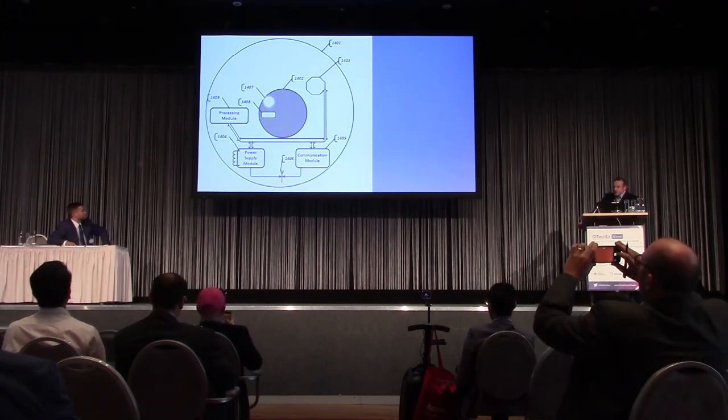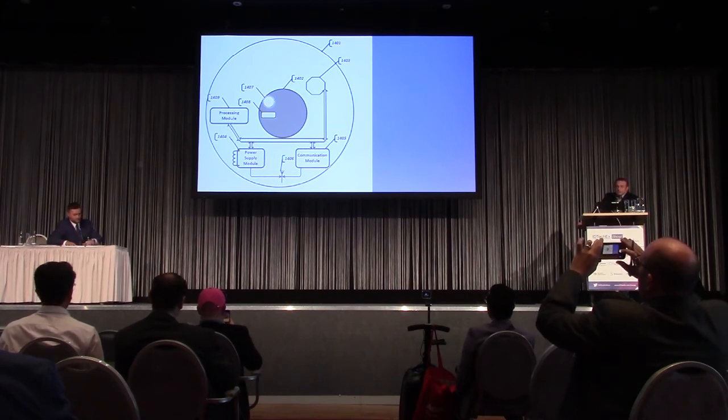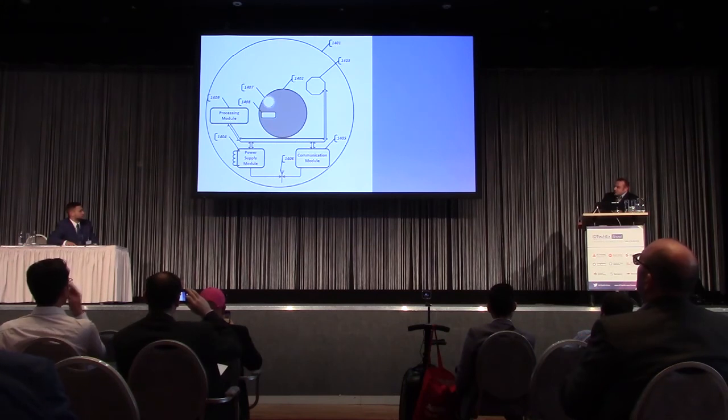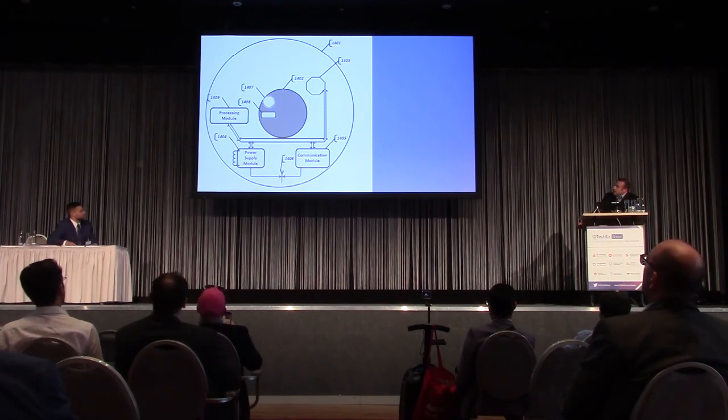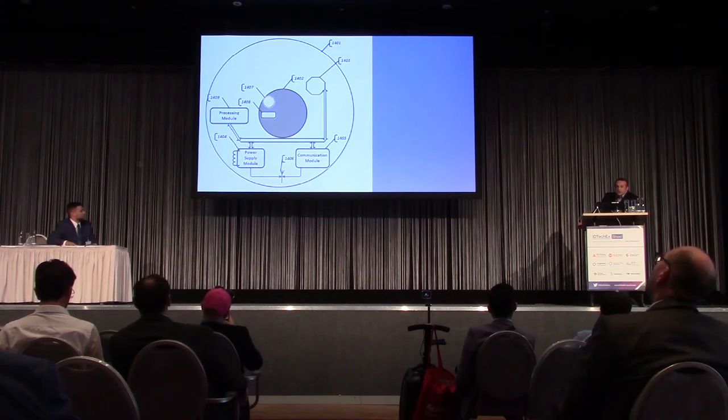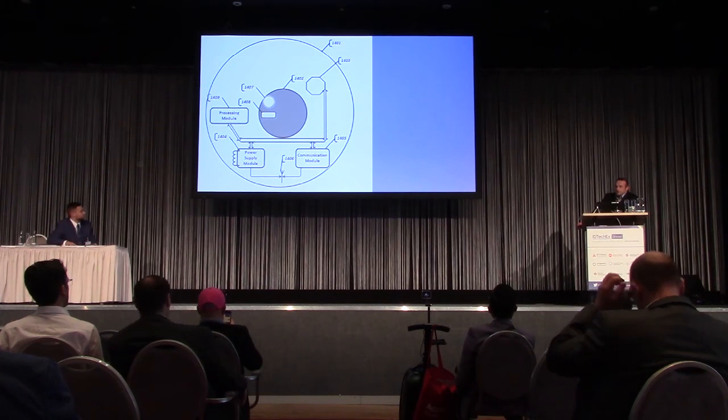So imagine that at 1403, this is an image capture sensor, right? That could be a CMOS sensor, perhaps. And 1402 is our embedded display. Now imagine that this display shows you buttons: record, play, pause, stop, maybe four buttons, right? If this is a video camera-like arrangement.